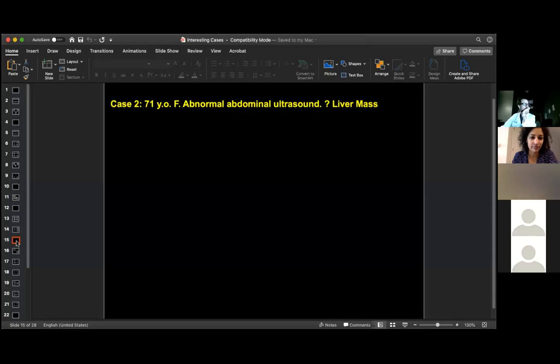Okay, so this is a companion case. This is Anu's case. So thank you, Anu, for having me show this. Kind of a similar look.